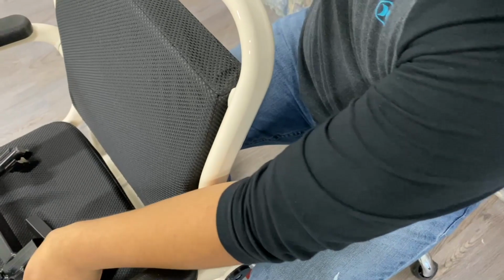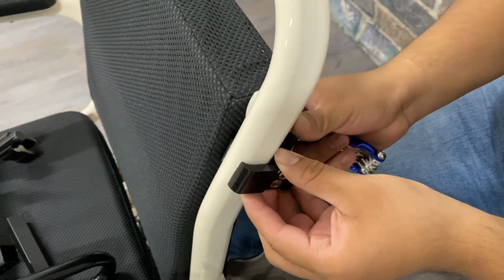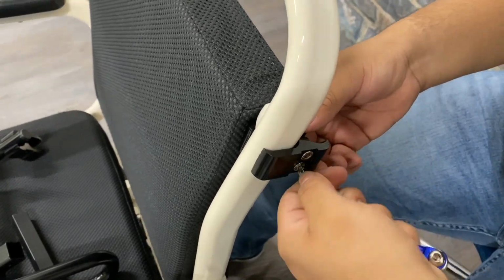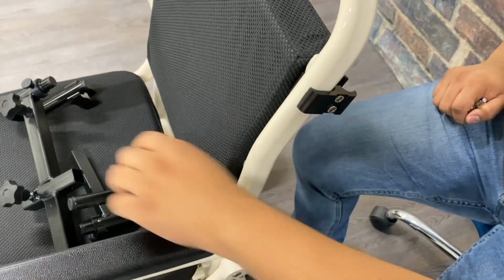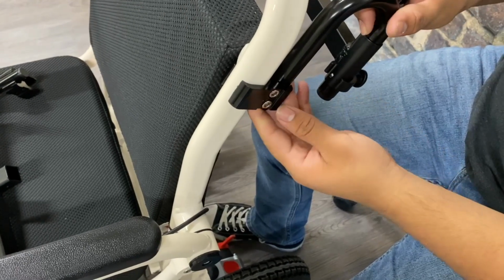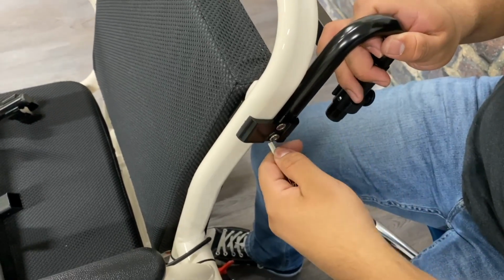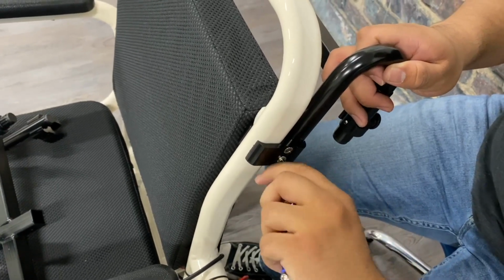You're going to take that C-clamp and attach it to the backrest frame of your MagSHOCK. You're going to want to slide it all the way up so it hits the top support beam of the backrest. Make sure that the bolts are facing out so you can tighten it up. Don't tighten it up all the way, because you're going to then slide in the U-shaped bar piece in the round hole of that C-clamp. Now, once those are together, you're going to tighten it all the way.